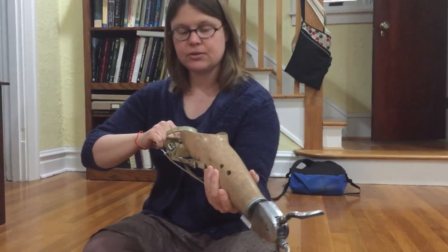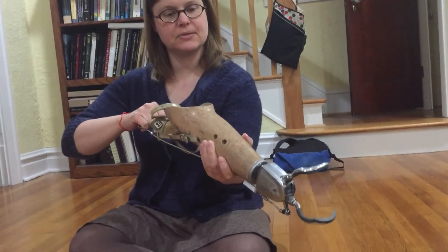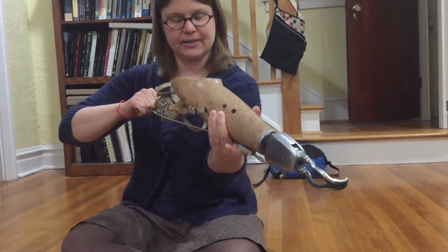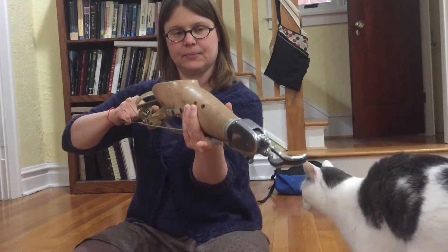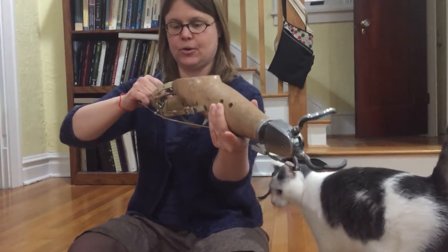Then he was able to use the motion of his bicep — he could contract his bicep to close the hook. So when he pulled in the cable, the APRL hook here at the end closed. It does have an automatic lock, so he could relax and it would stay closed. Then he would pull again to open — one pull to close and one pull to open.